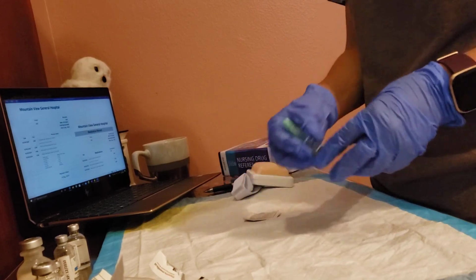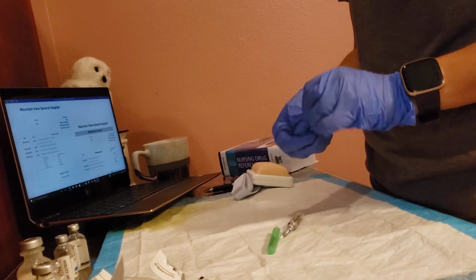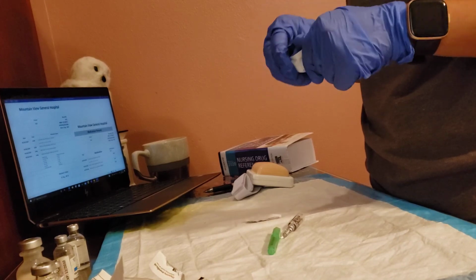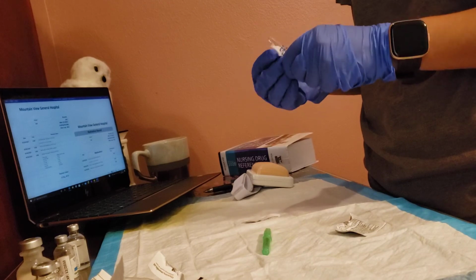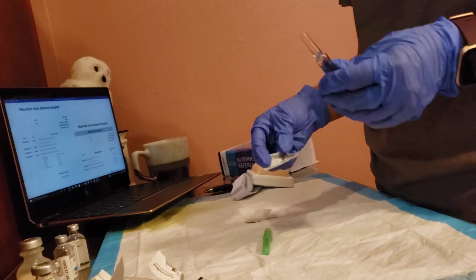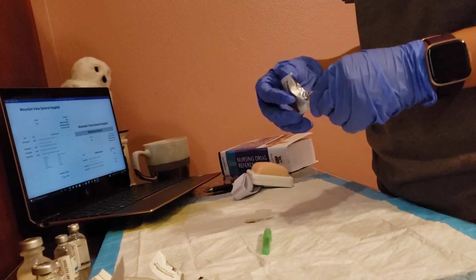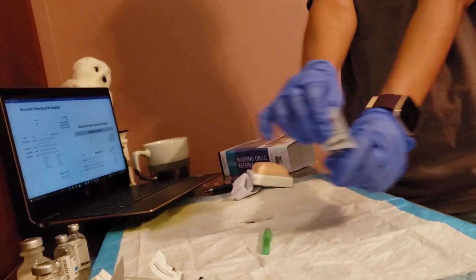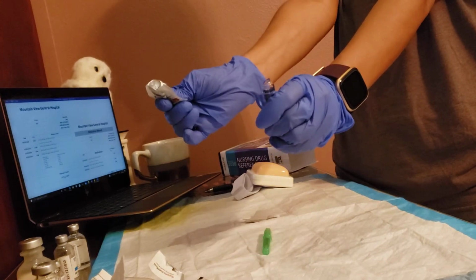So next we're going to move on to my ampule, and I'm just going to clean it and show you how I would open it. So I would clean it, and then I would place it into this little baggie here, and I would hold it away from me and away from the patient, and I would just pop it off.